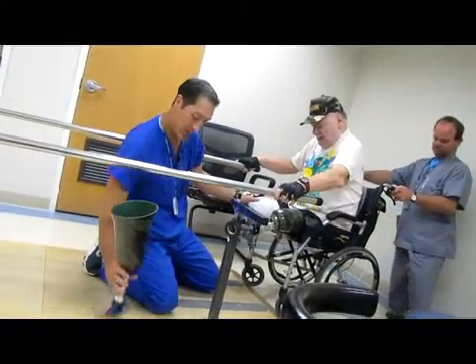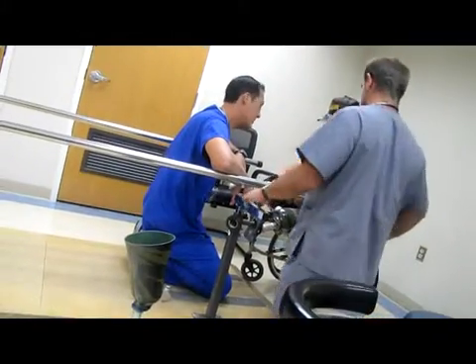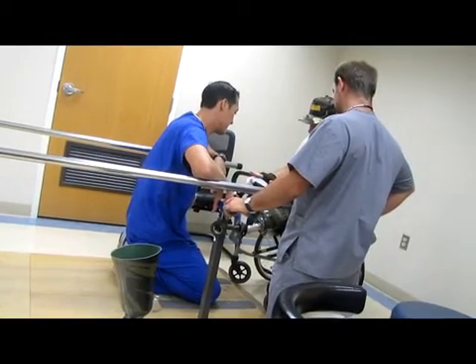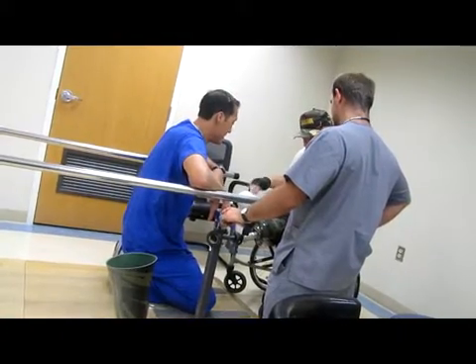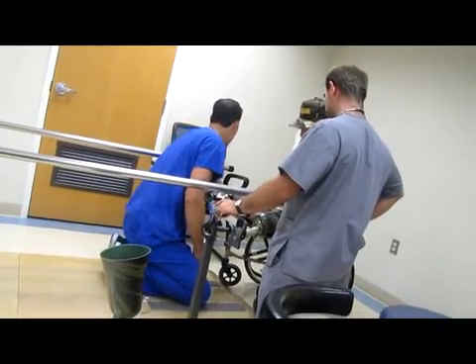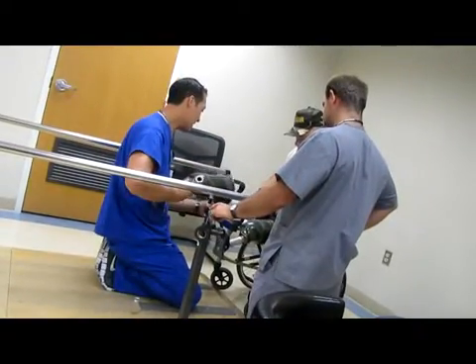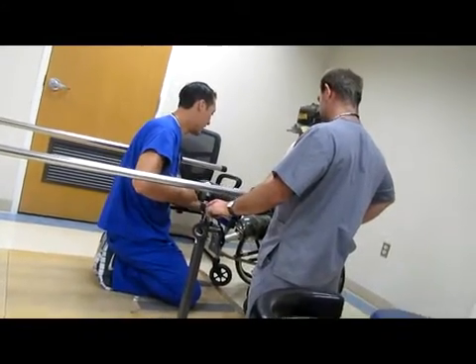Anyway, where it hurts is, inside there's still a little pain if you push on it this way, the flesh or whatever. Not on here. It was kind of like squeezing it and pushing it in this way, it felt internal. It was off the bottom by like three quarters of an inch too. Could you pull this one up? I'm curious to see what this looks like with the shrinker on instead, and see if I could at least get this pushed up all the way.